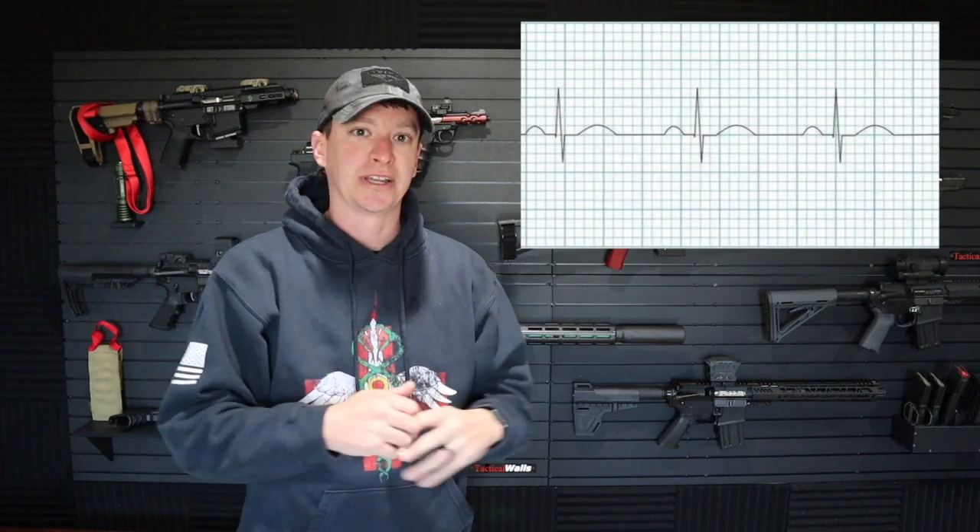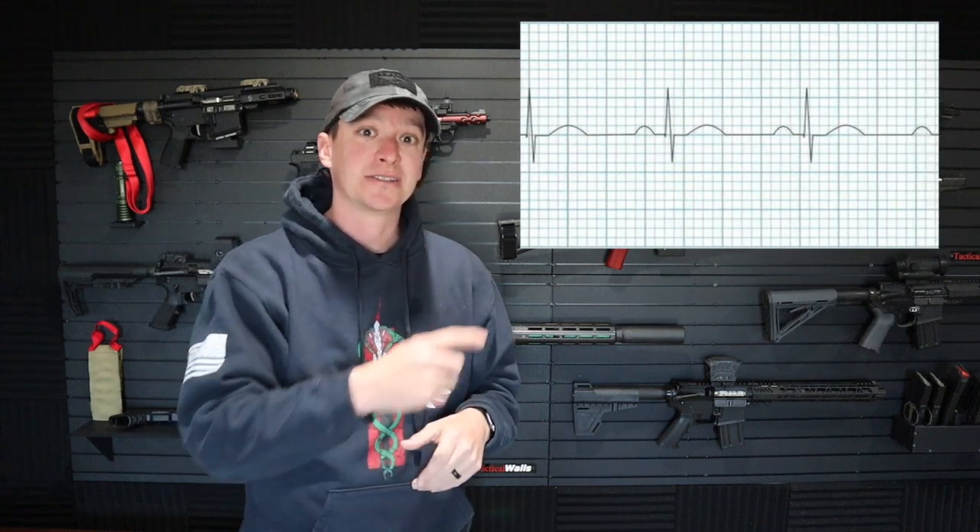So first of all, this is what a normal heart rate is supposed to look like. You have your P wave, which is your first little bump there. And then we have what's called the QRS complex — this is the big wave that jumps up. And then you have a T wave. Hopefully, if you're at the doctor's office or the paramedic is putting you on the heart monitor, it looks similar to this.